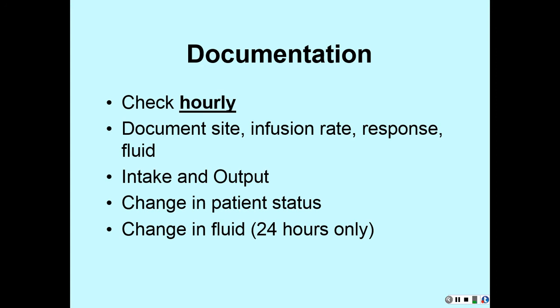You need to know if your IV is on a pump. Of course, we're documenting intake and output. Any patient who has IV therapy should be on intake and output.